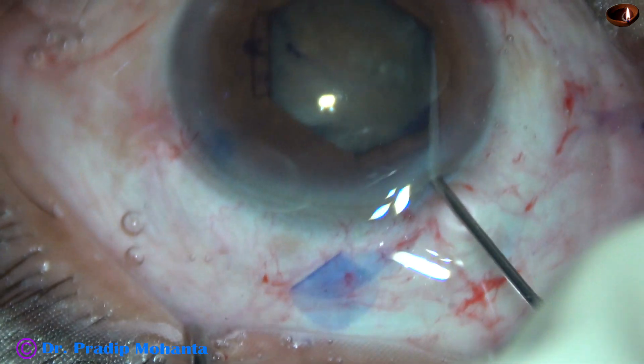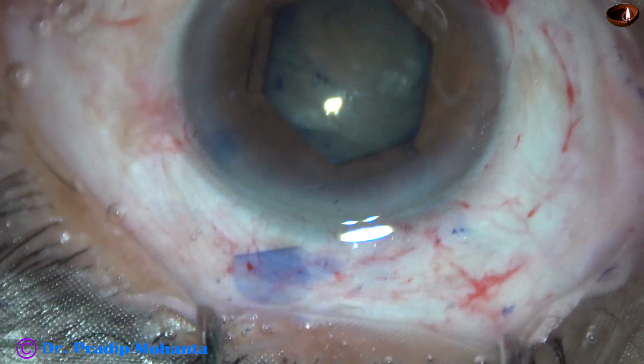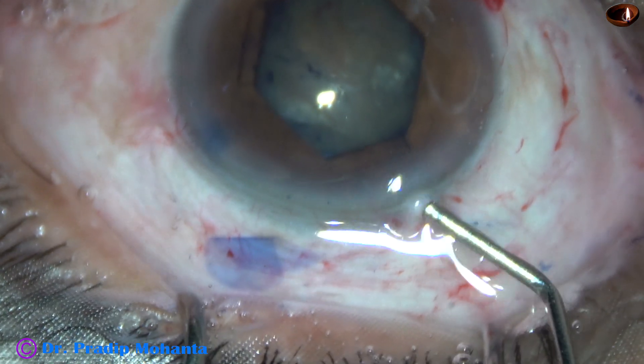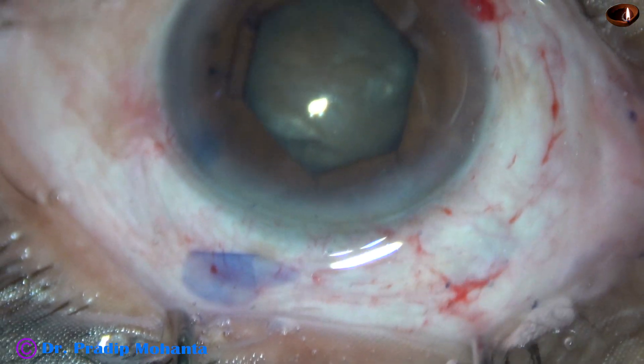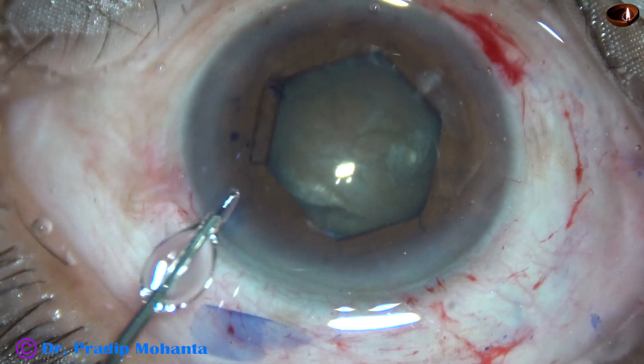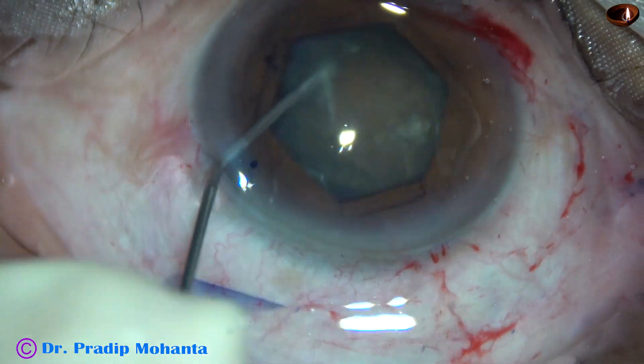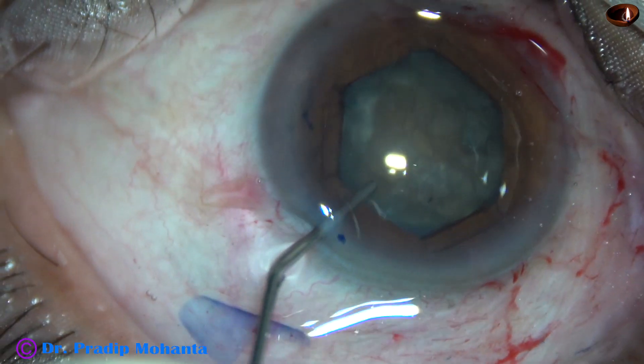Hydrodissection is now done. Small amounts of fluid are injected at multiple areas. The nucleus is tapped gently and then rotated. I find that the nucleus is rotating nicely.